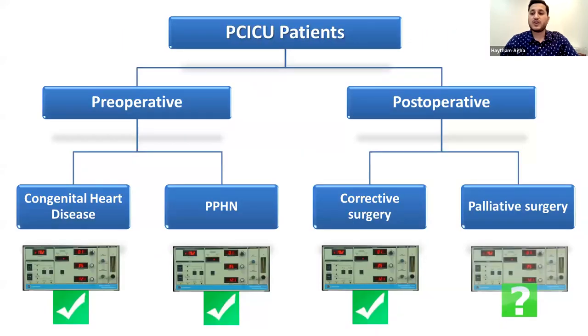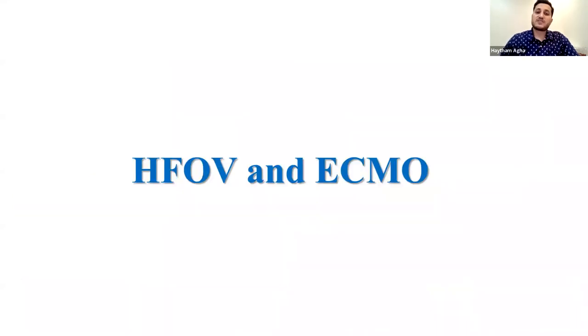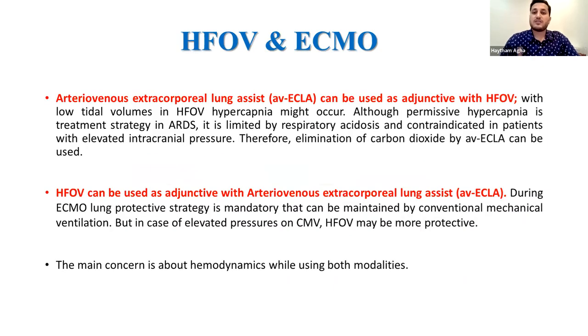But anyway, it's still debated whether high frequency oscillatory ventilation can be used after Fontan operation. So now let's talk about high frequency ventilation and ECMO. How can, or why can, we use high frequency ventilation in ECMO? As we know, ECMO gives us a dramatically good ABG, but during ECMO, we should put the patient on conventional mechanical ventilation with a protective lung strategy.